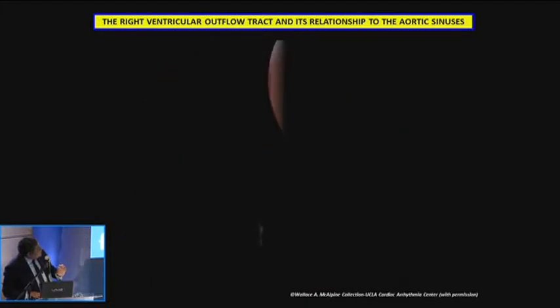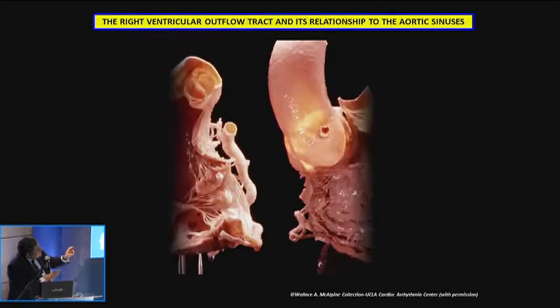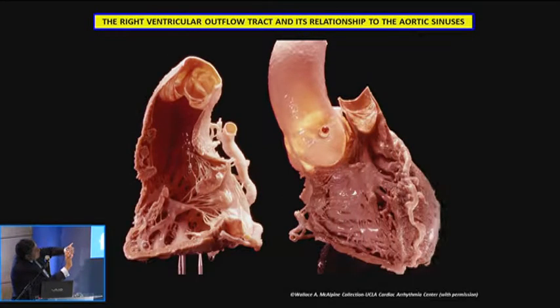So if you look at that, I'll show this again for you. If you open the RV free wall and open this out, this is how it looks in the RVOT. Points to be made over here: if you look very carefully, the right ventricular myocardium wraps around the right aortic sinus, right? This is the pulmonic valve, which is, of course, offset. And this is the free wall. So all these areas are areas from which you get VT.